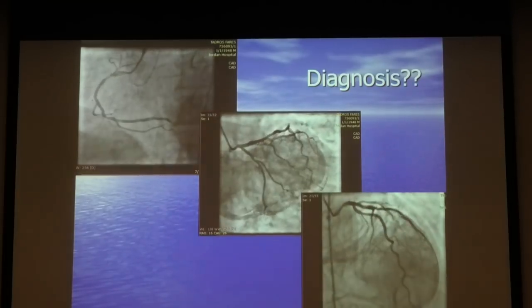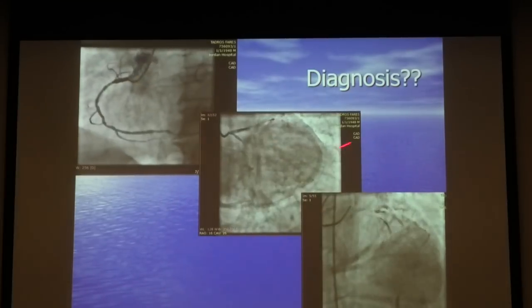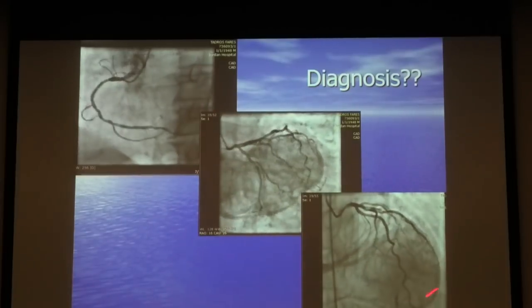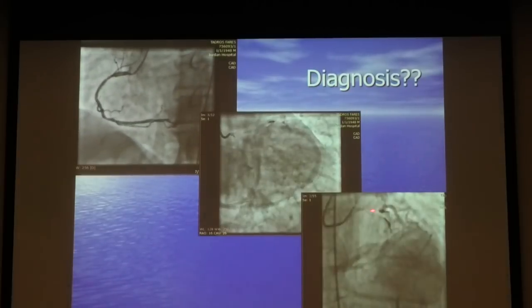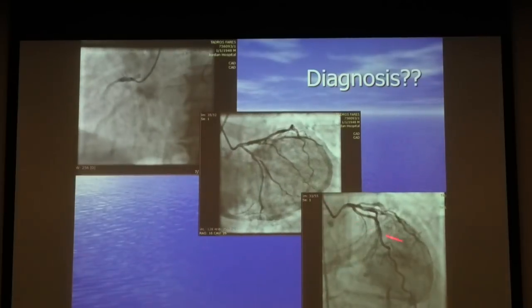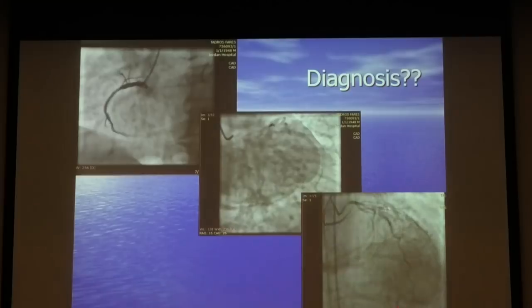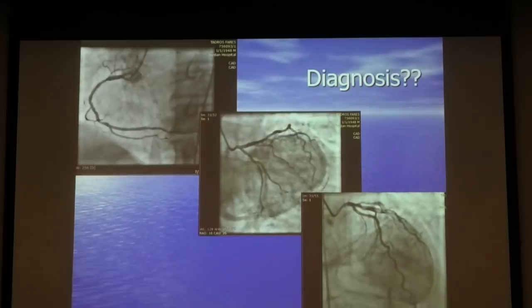Okay, so you see no backflow, the left main. The myocardial blush, when you see it like this, this is a true ostial. There's myocardial blush, it means that there's no flow. There's no clearing of the contrast. So you have to be very careful. There was some damping of the pressure. The thinking was, let me take more views. It is a spasm maybe, and then I'll go back to re-imaging it. But anyway, this is really serious. When you see that the venous flow is not clearing up, there's no forward flow. So you have to be very careful. Don't take your risk. Anyway.